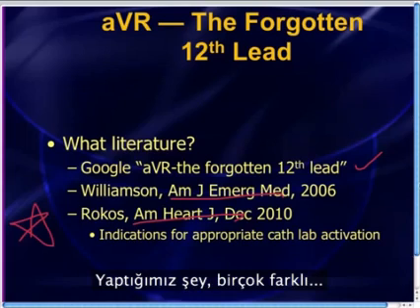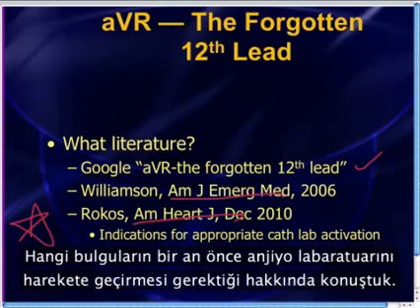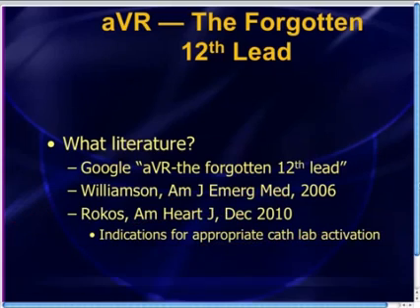And what we did was we talked about a handful of different EKG findings, which we are proposing should be appropriate reasons to activate the cath lab, and ST elevation in lead aVR is one of those indications based on the literature we've seen.